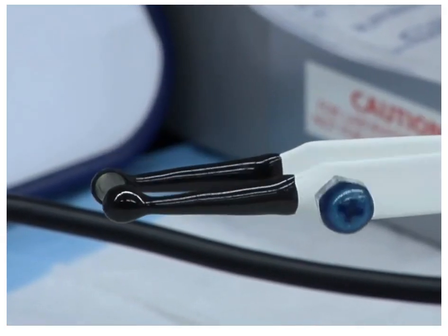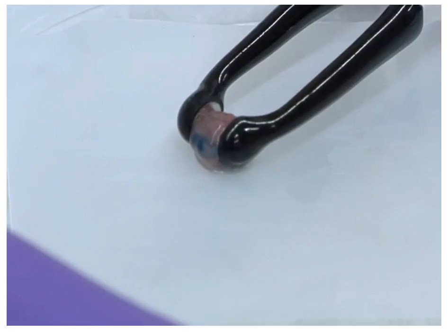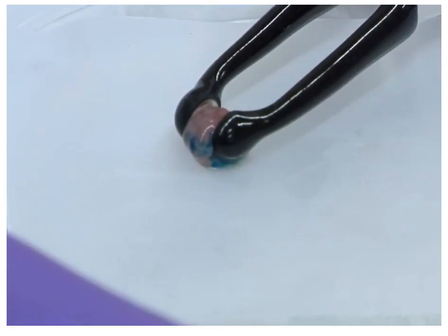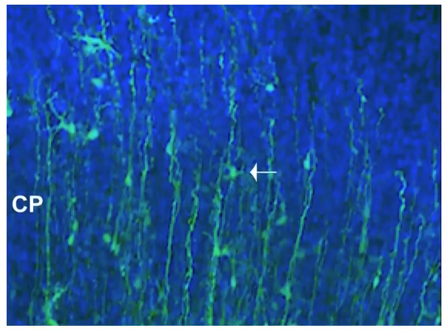Here, tweezer electrodes are placed around a mouse brain, and short pulses of electricity are passed through the brain to initiate ex vivo transfection of the injected RNAi molecules within the blue solution. The effects of gene silencing on the structure of the developing cortex is then observed.